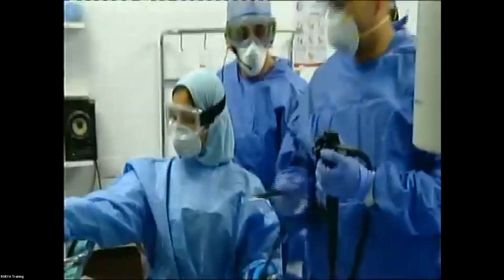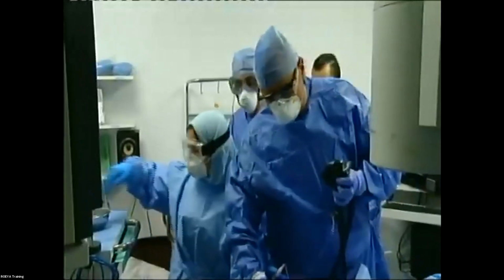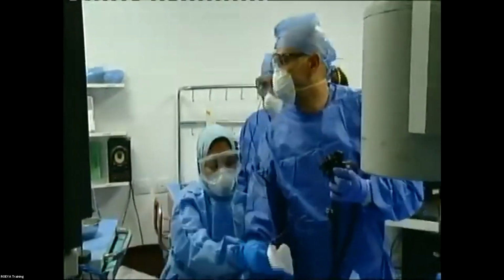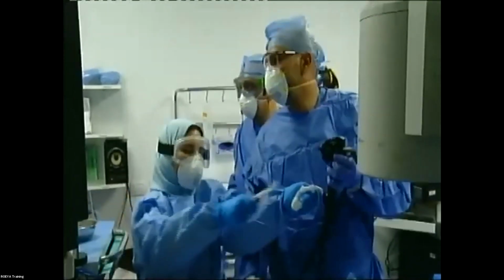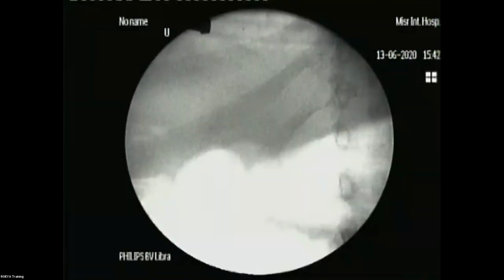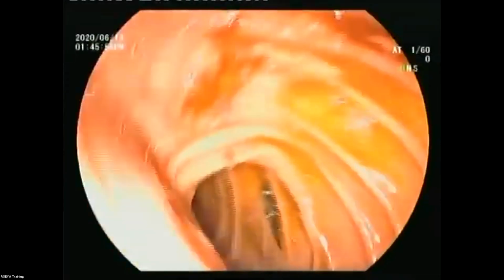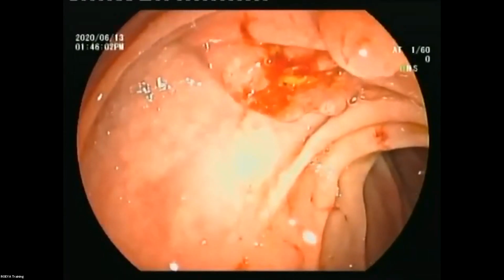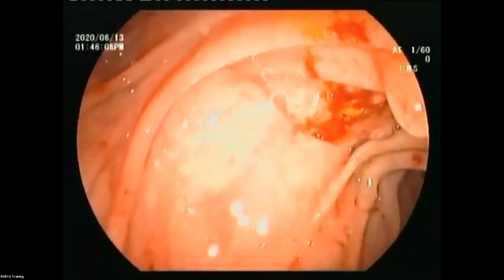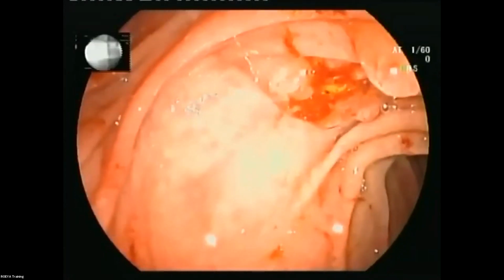So, Hani, what's the next step? You make sure you clean the common bile duct and that there is no more residual. Of course, usually with these stents, for a long time, you always find debris and maybe some stones. So you need to go in and do a good cholangiogram. Normally you cannulate now with a balloon directly or with a sphincterotome? Let's go with a balloon because it helps us do an occlusion cholangiogram, which is very important in this case, to really confirm that there is no residual stricture.